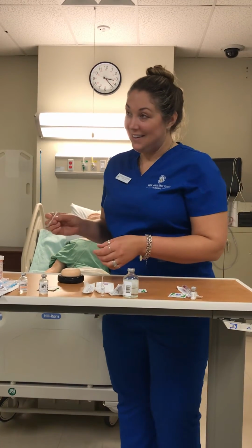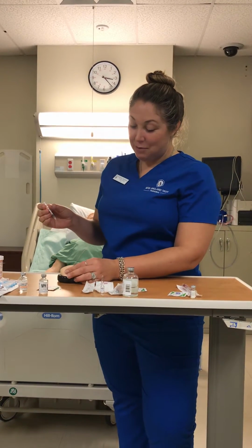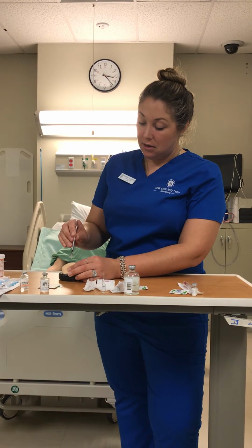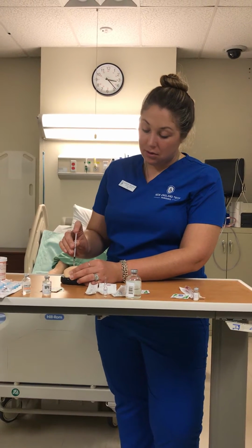And then I would take the needle. I would pinch the skin depending on which part of the body they need it on. At a 90-degree angle, let go.